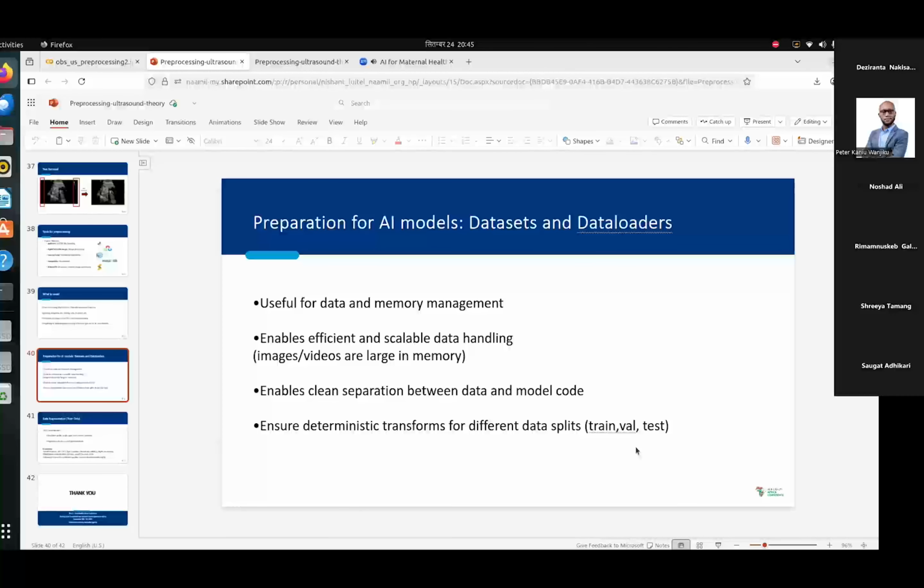In those cases you would want the video to have all the frames so that the model can use the temporal information. But when you do gestational age estimation, you might remove most of the frames and try to find the standard frames, the ones that often carry information related to the size of the fetus, which is related to the age.